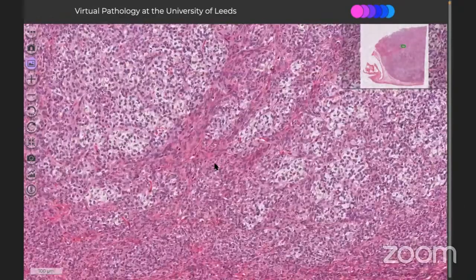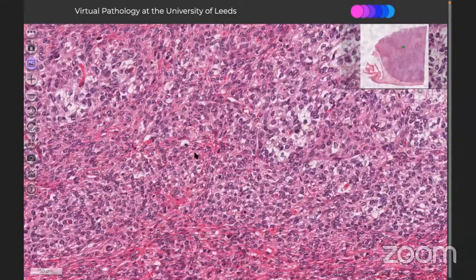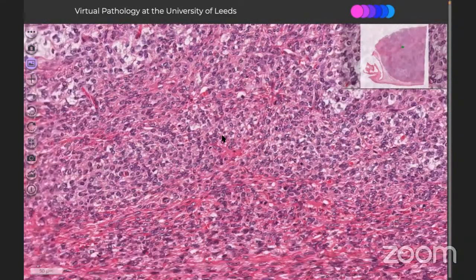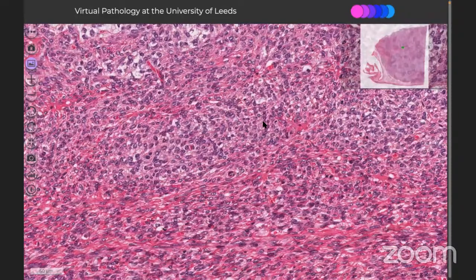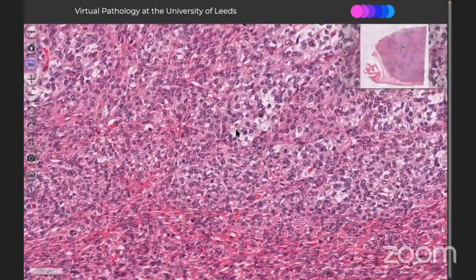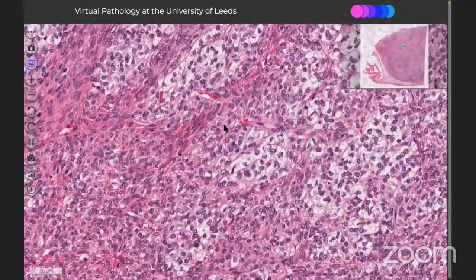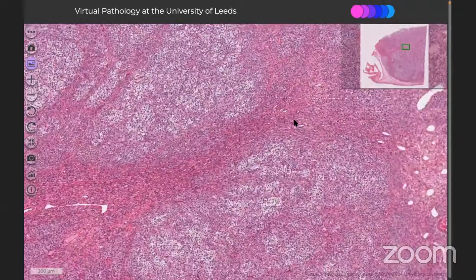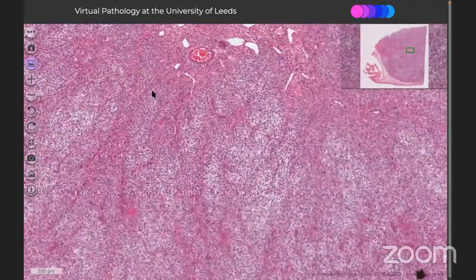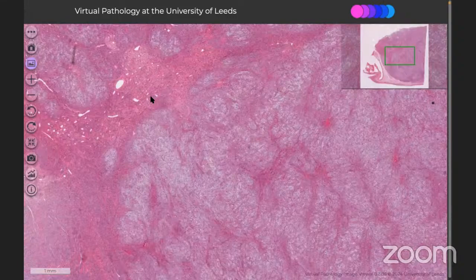And if you move on to the less cytoplasmic area, these cells are plump. It is not that spindly that we see in case of fibroma cases, but they are kind of plump to ovoid in nature. And gradually, if you move on to the luteinized area, obviously they gain some clearing in the cytoplasm and an increasing cytoplasmic volume. There is no necrosis, no atypia per se, and no increased mitosis also. So this is an impression which can give you a sex cord stromal lesion.